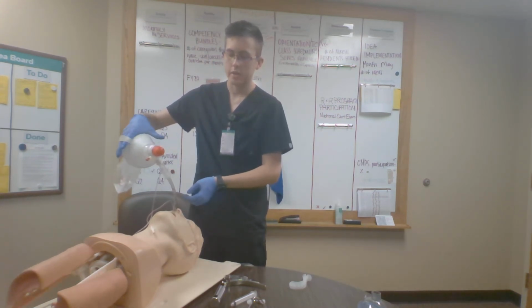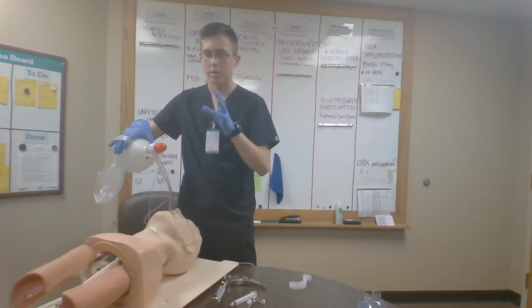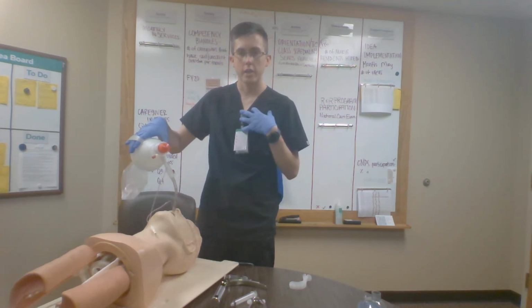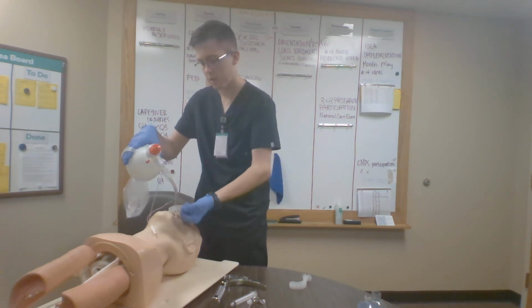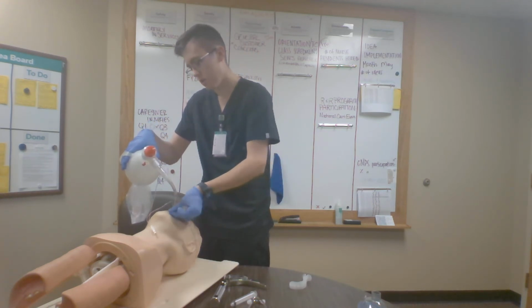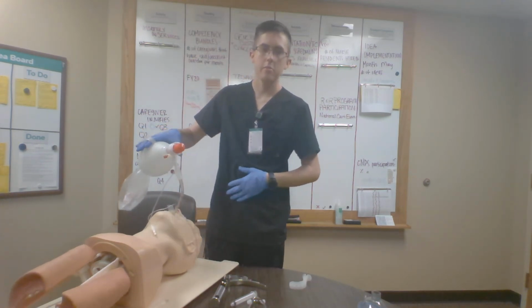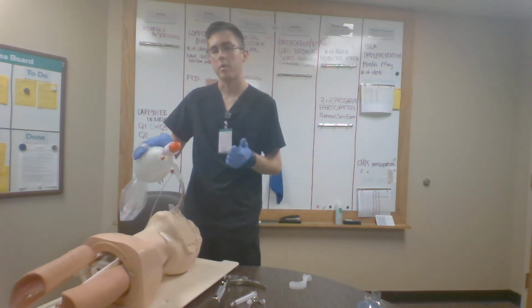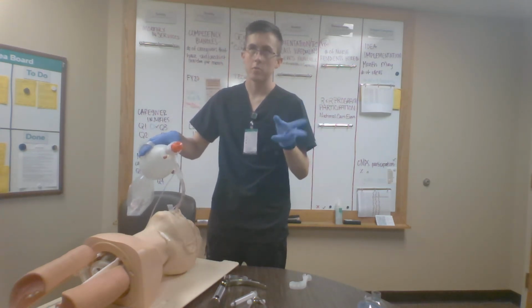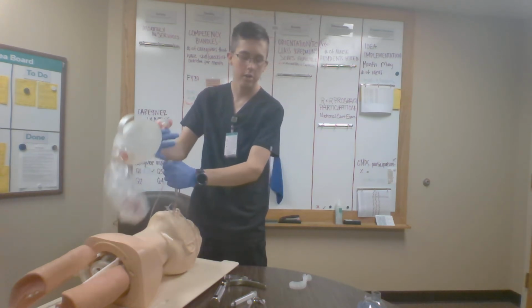and continue to ventilate my patient. Once I see that I am getting proper capnography, I was able to listen for ventilation in the lungs, not in the epigastrium, I will go ahead and secure my tubing. And then I will continue to monitor my patient for any signs of hypoxia. I will watch over capno as well as for any signs of hypoxia and evaluate my SpO2 monitor.